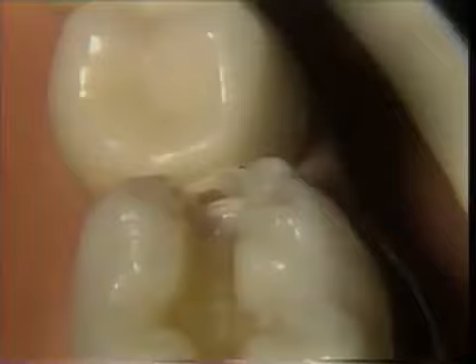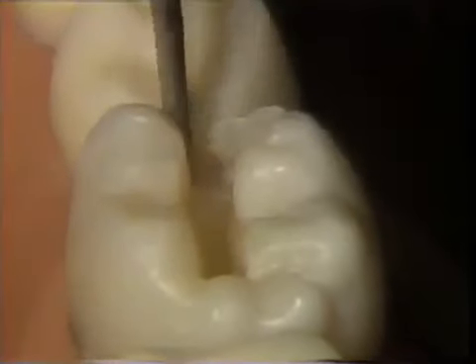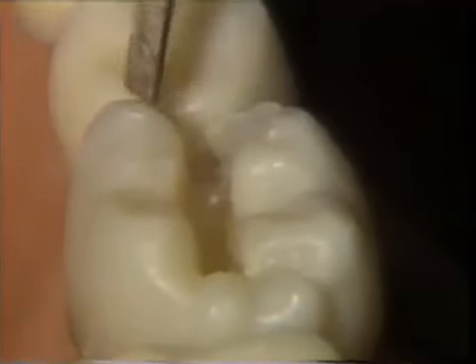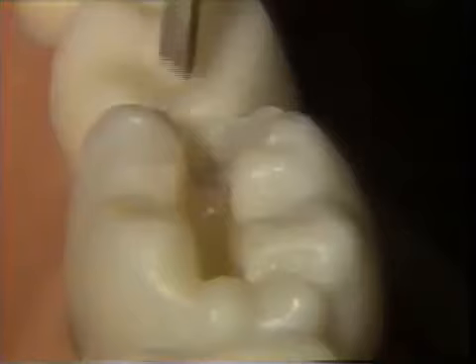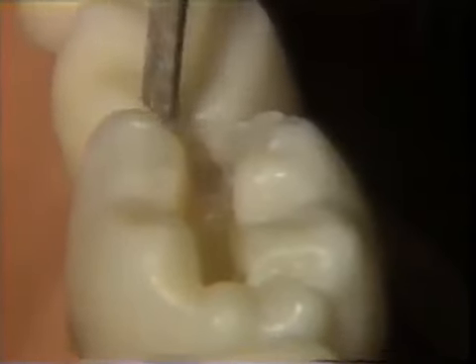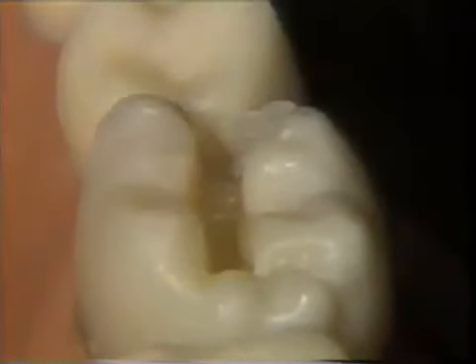An enamel hatchet is used to accomplish 4 objectives in this cavity preparation. First, to extend the proximal walls. Second, to place a proper flare on the proximal walls. Third, to prepare the cavo surface margins of the proximal walls for acceptance of the restorative material, and fourth, to smooth the cervical floor.